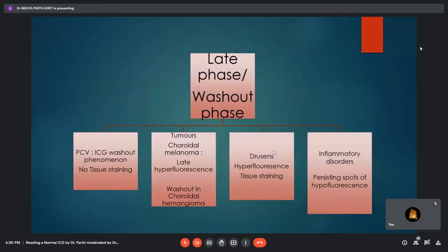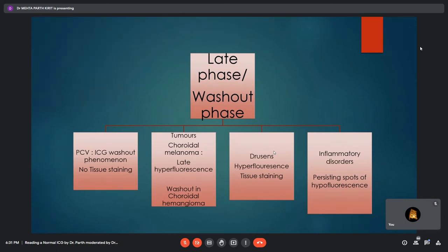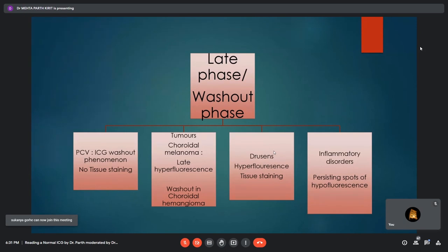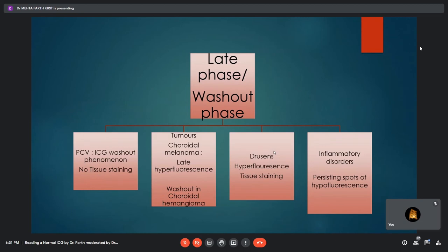In the late/washout phase, in cases of polypoidal choroidal vasculopathy, the ICG washout phenomenon is important: in early phases the polyp appears hyperfluorescent with a hypofluorescent margin, but in the late phase there may be reversal — hyperfluorescent margins with the polyp appearing hypofluorescent. In choroidal melanoma, late hyperfluorescence and dual circulation can be demonstrated. Choroidal hemangioma shows distinct washout. Inflammatory choroidal disorders like VKH, multiple evanescent white dot syndrome, and serpiginous choroiditis show persisting spots of hypofluorescence in late phases.